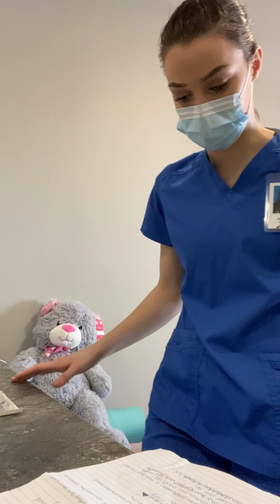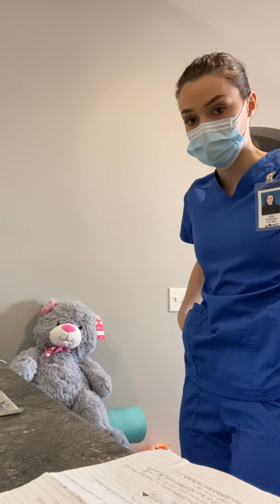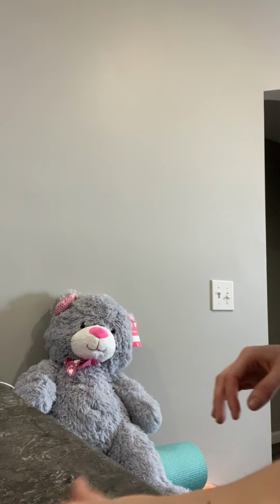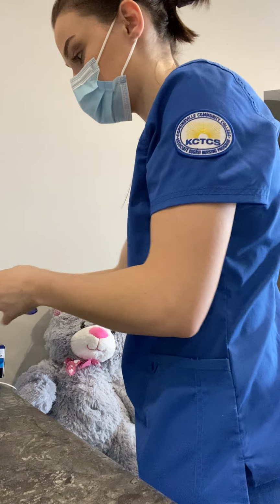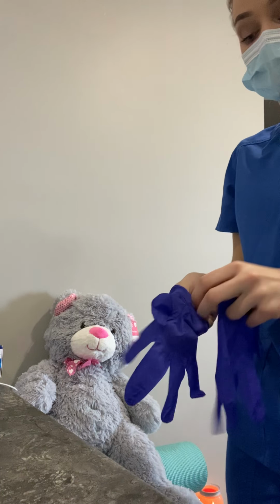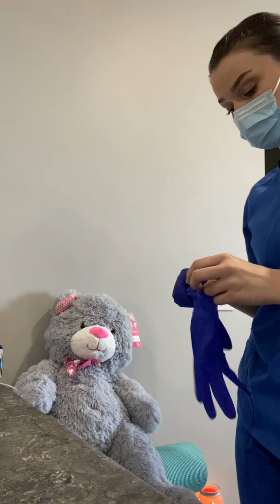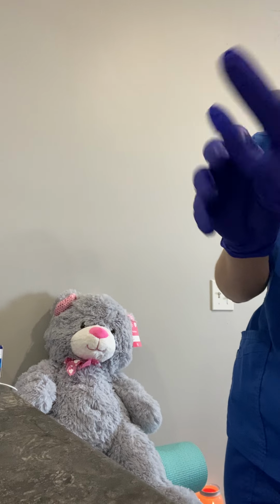Okay, so she's got some fluids running right now. I'm going to go ahead and stop those fluids. Okay. We stopped those. I'm going to put on my clean gloves. Let her know what we're doing. So, Miss Teddy, your physician wants some blood samples on you so he can get a CBC, check kidney function, whatever he needs to do. We just need to get that blood drawn.